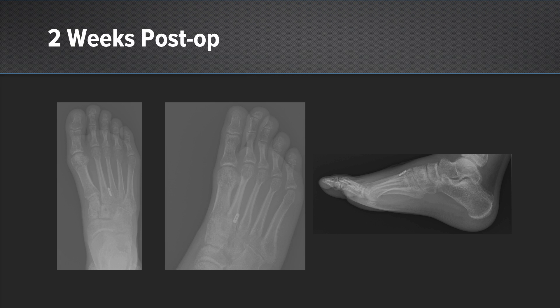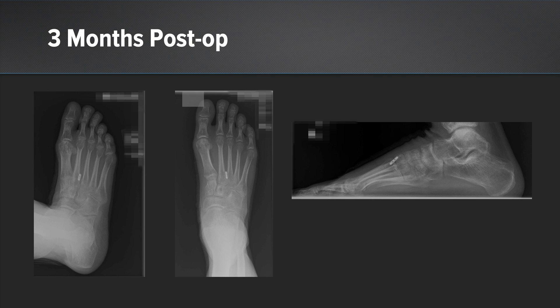At our two-week post-op, his foot reduction looks excellent, and you can see the position of the button is ideal as there is significant soft tissue coverage over the dorsum of the foot, which minimizes the risk for soft tissue irritation with the metal implant. At our three-month post-op, on the weight-bearing views, we see no diastasis at the Lisfranc articulation — his foot is stable and he is pain-free.